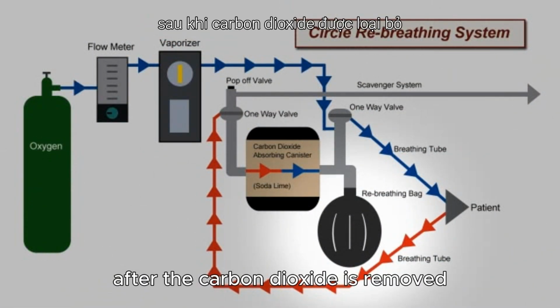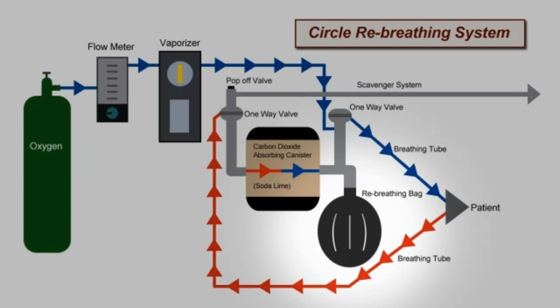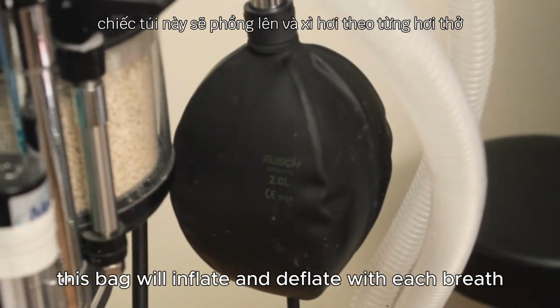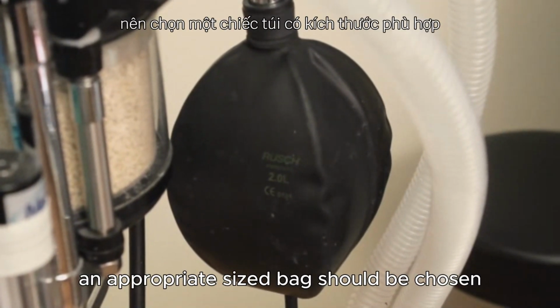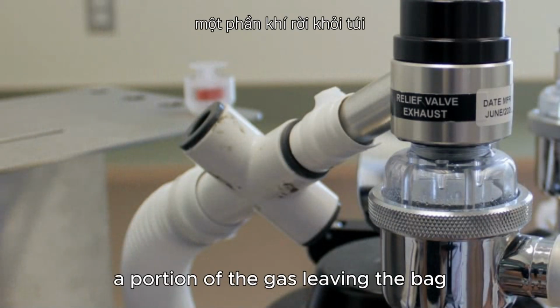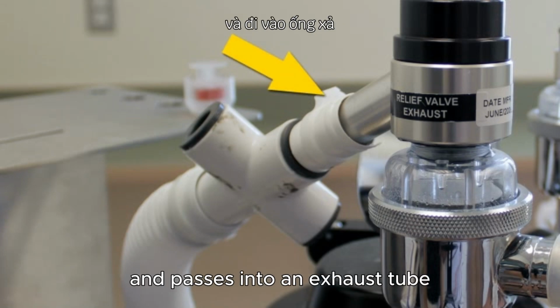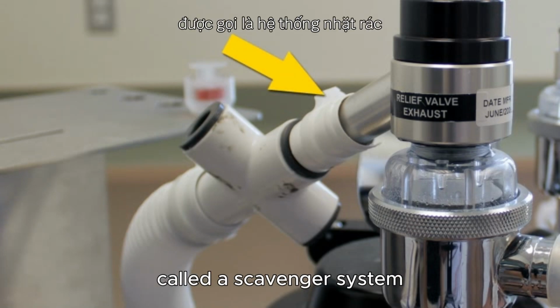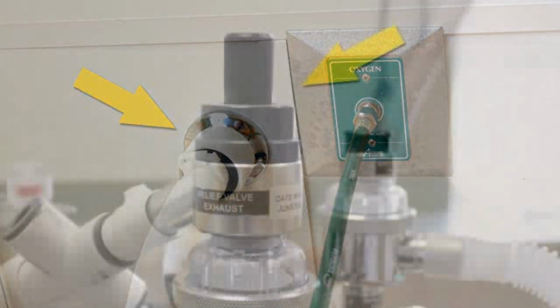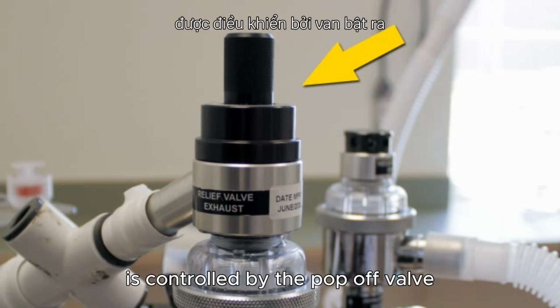After the carbon dioxide is removed, the exhaled oxygen and gas enters a rebreathing bag. This bag will inflate and deflate with each breath, and therefore an appropriate sized bag should be chosen for each animal. A portion of the gas leaving the bag leaves the system entirely and passes into an exhaust tube called a scavenger system. This gas should be vented outside. The amount of gas leaving the anesthetic circuit is controlled by the pop-off valve.